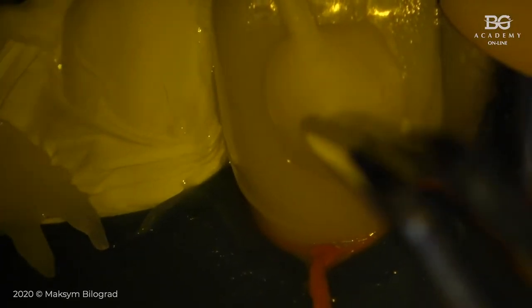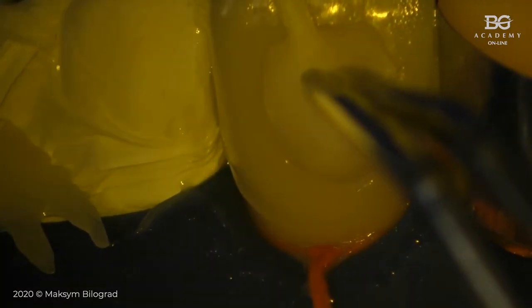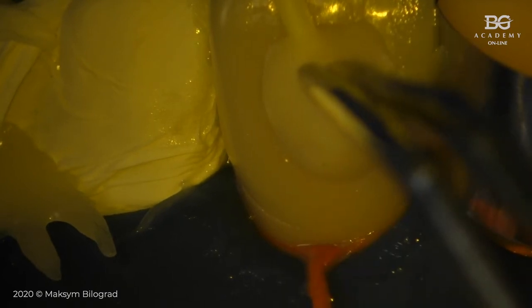So this is not a good idea, to make a pre-curing. I press, okay, hold. What I can do, I can remove this excess also. And then from the area of the central incisor, I can take out this matrix.